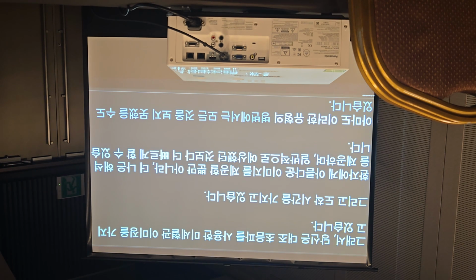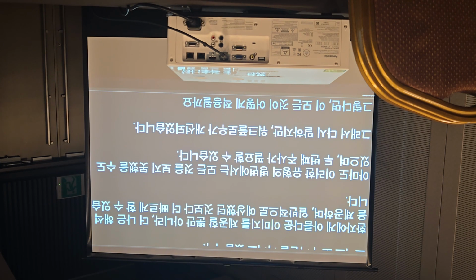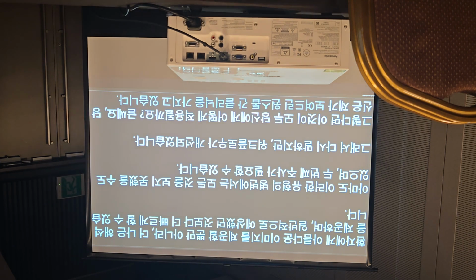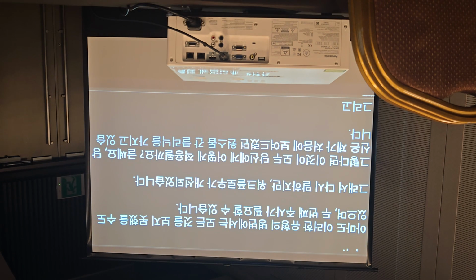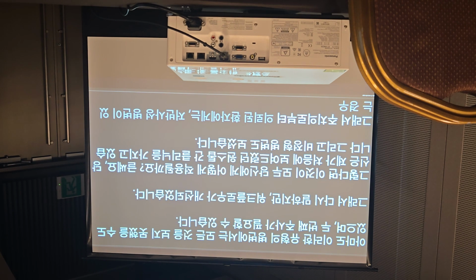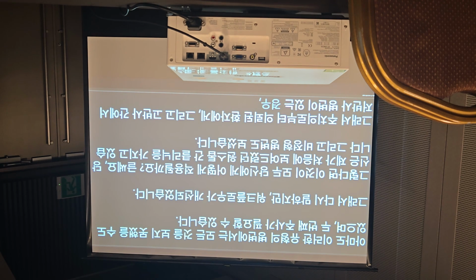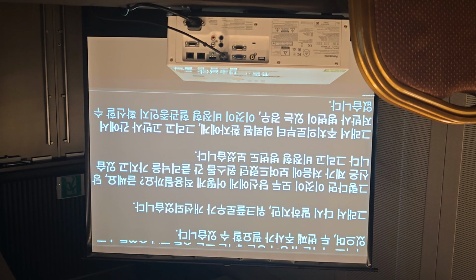So how does this all apply to you? Well, you've got your one-stop liver clinic, which I showed you at the very beginning, and you've seen also the lesions that are atypical. So in a patient that's referred from your primary healthcare physician, and you have a focal low reflective lesion in the high reflective liver, you're not sure whether this is an atypical hemangioma, which will be the most common abnormality, but it doesn't conform with your conventional teaching of being echogenic. So this is all going to change over time.